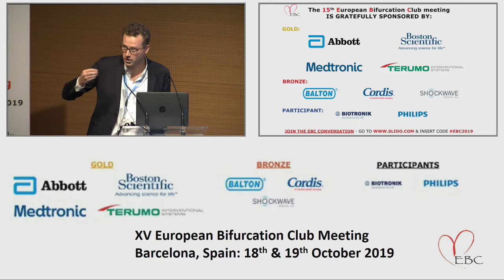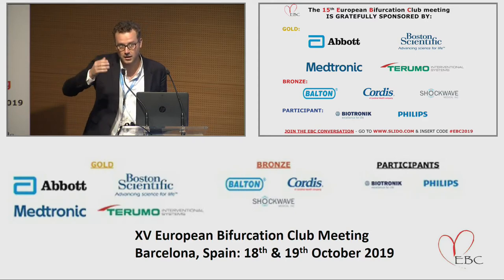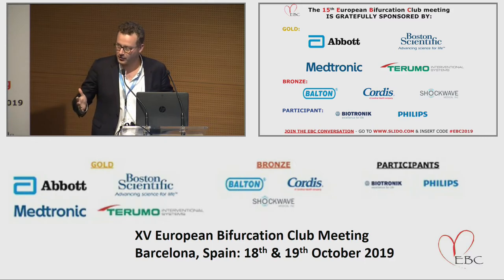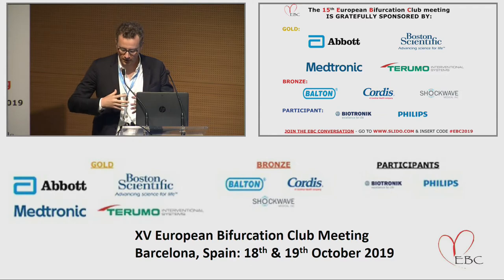The pressure is just the pressure needed to reach the artery to push the stent until the vessel. Gérard Finet will finalize a very nice experimental paper to analyze the mechanical properties of the balloon, and it clearly shows that the force to push the stent is very low, around 1.5 atmospheres. So you don't need a force, you need to move the stent. So you need to get the balloon which offers the larger range of diameter.